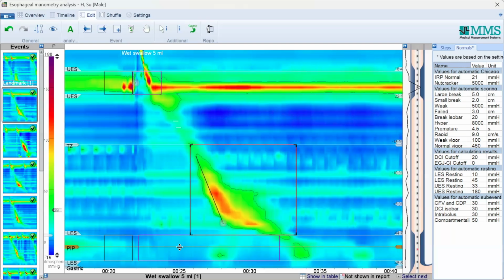And we usually see other things as well. Sometimes if it goes too far, too long, you get what's called a sigmoid looking esophagus. It looks almost like a sigmoid colon. You start finding sometimes food debris. You may find quite a lot of mucus or fluid hanging around in the esophagus. And at the same time, you can see that the esophagus becomes quite fibrotic, quite hard. The longer it goes, the more difficult even treatment becomes because of the fibrosis.